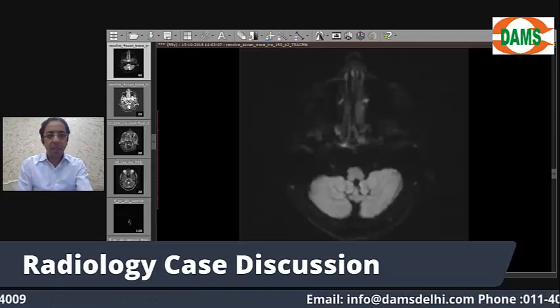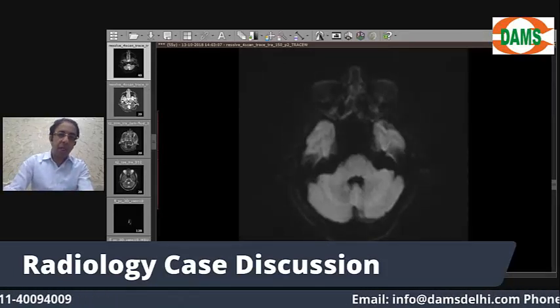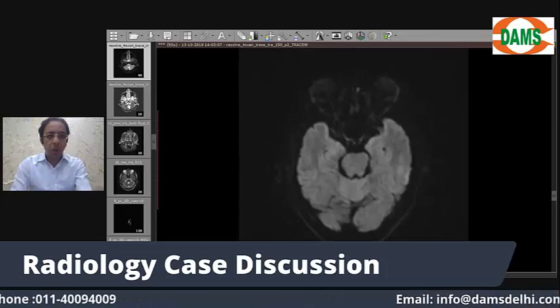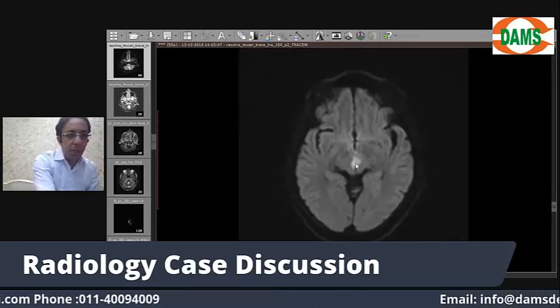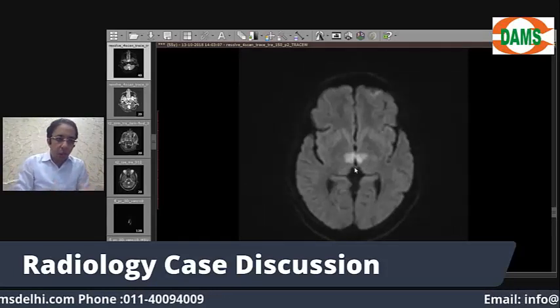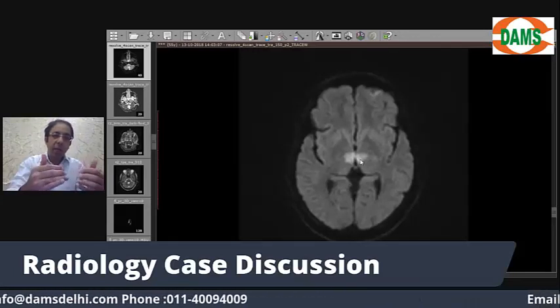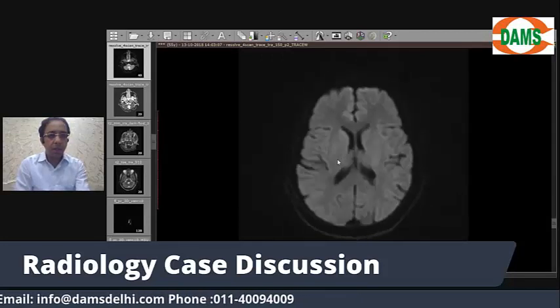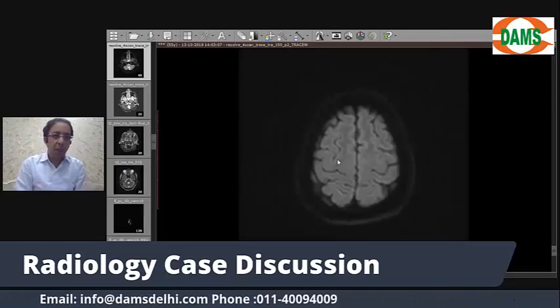I'm tracing the diffusion-weighted MRI from below upwards. There is no abnormal high signal in the cerebellum, pons, or temporal lobe. Going up, the scan is normal. But now in the rostral midbrain area, you can see some hyperintense signal — this represents an acute infarct. Going further, I also see hyperintense signal in bilateral paramedian thalamic areas. So rostral midbrain and bilateral paramedian thalamus are showing areas of acute infarct on the DWI.